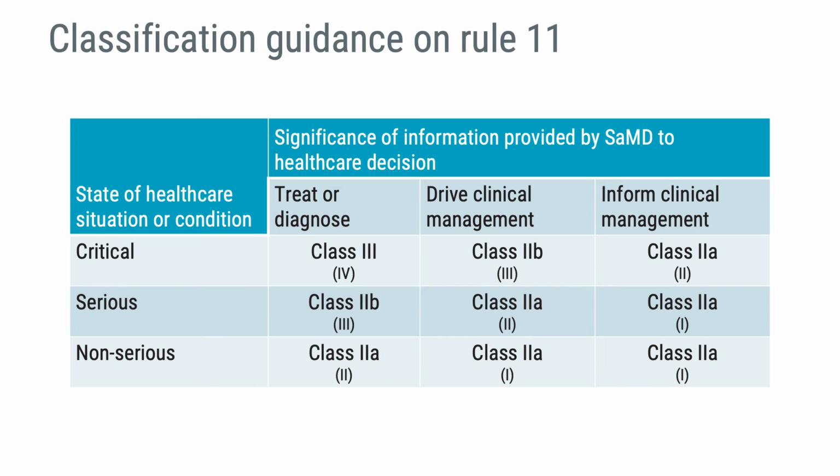Unfortunately, the SaMD categorization has been disconnected from both standards and established regulations, but is now slowly getting more and more traction. Earlier in this video, I told you about a guidance document on the MDR Rule 11. This is one example where SaMD categorization has become useful. The table I just presented is used in a guidance document and looks like this. Here you see a comparison between medical device classification and risk categorization from the SaMD guidance. It is worth mentioning that Class 1 medical devices do not even qualify to be in the table. This again emphasizes that almost any medical device software according to the EU MDR is likely to become at least Class 2A.